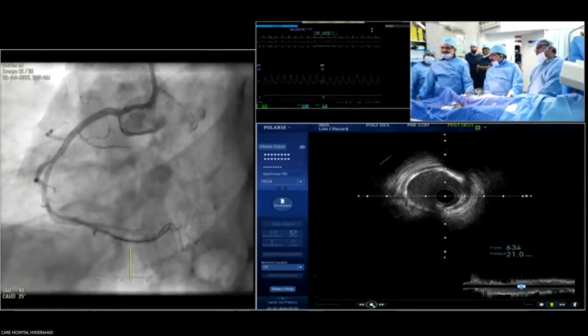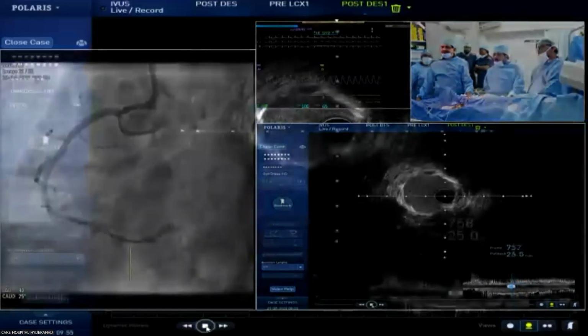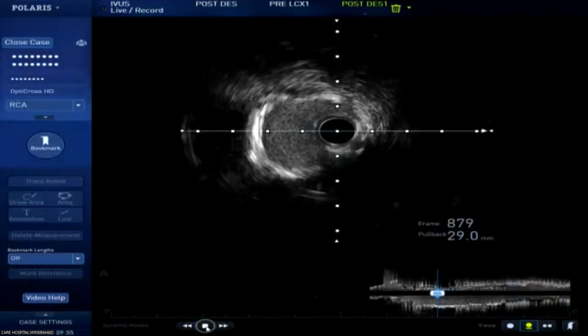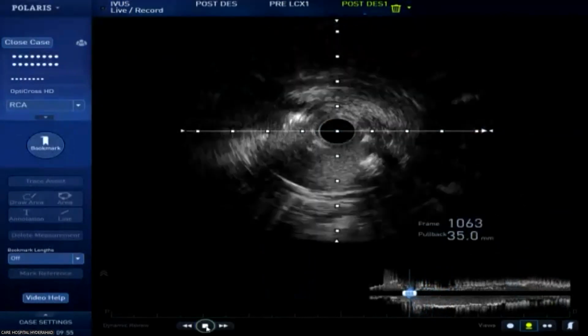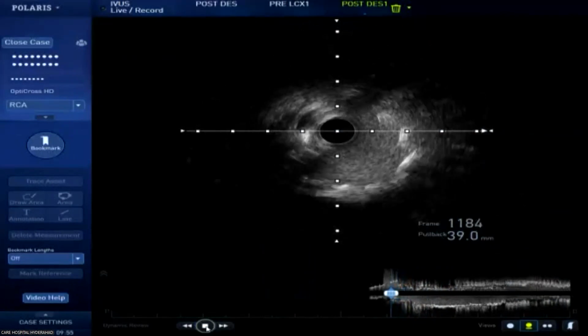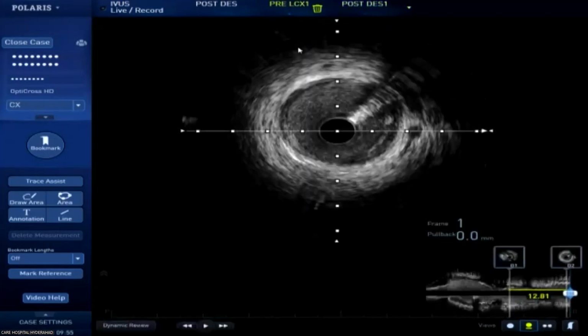That's a lovely final result. It's a was-live case, not so much an is-live case. At the same time, he had a left circumflex ostial lesion, a very nasty lesion in the circumflex. So just now we are finishing this way. We have done this again with the same Wolverine 2.75 positioning, so as not to get into the left main.